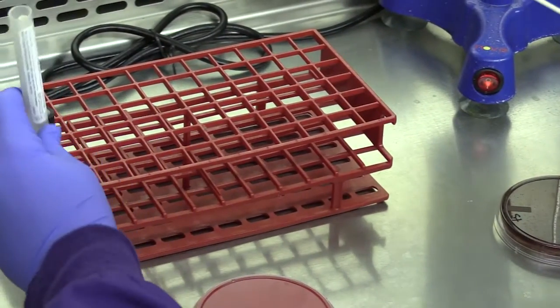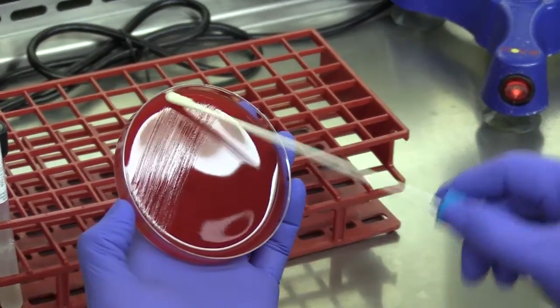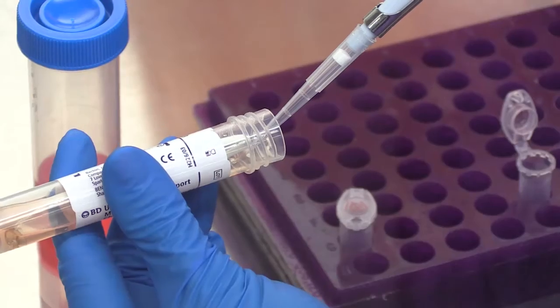Submitting swabs for diagnostic testing is an important part of many case workups. Swabs may be collected for bacterial culture, fungal culture, or PCR testing.